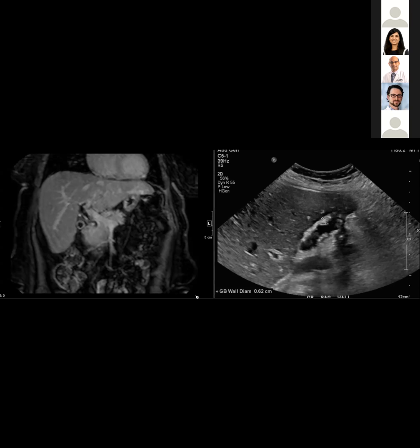But as far as workflow, it's fairly easy for ER and inpatients because you have kind of time on your side. For outpatients, a little more difficult, but we do have sonographers who are really good about shuffling the schedule around and making room to bring the patient back into the room after an IV is placed to characterize an incidental liver lesion or renal lesion, or check if a vessel is thrombosed or not. So, yeah, thank you.